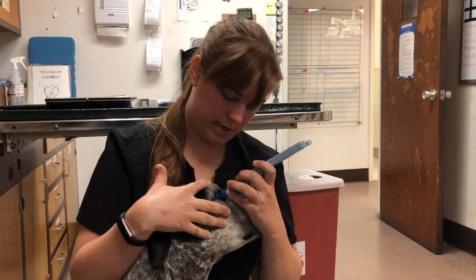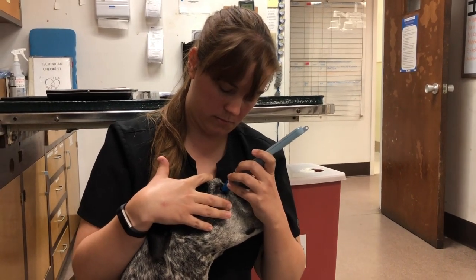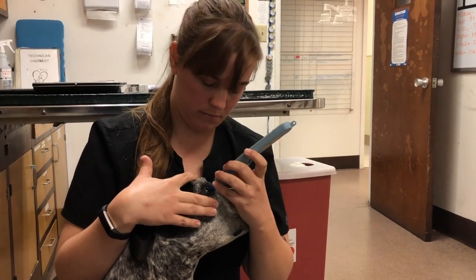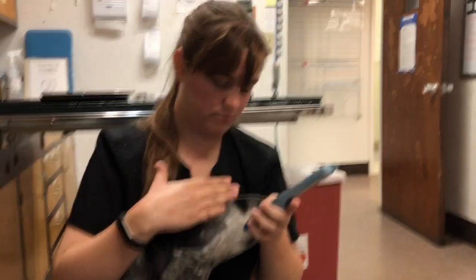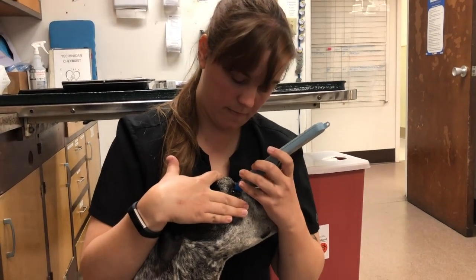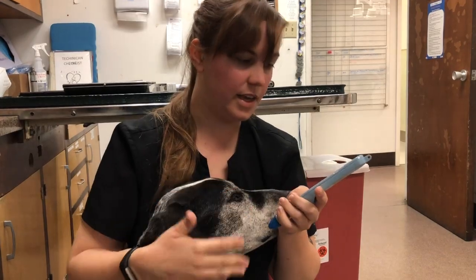And I'm just gently tapping on his cornea. 6. 4. And 8. Fluorescent stain is generally used to detect corneal ulcers and any abrasions or roughness on the cornea.